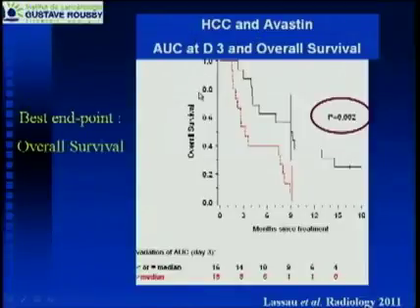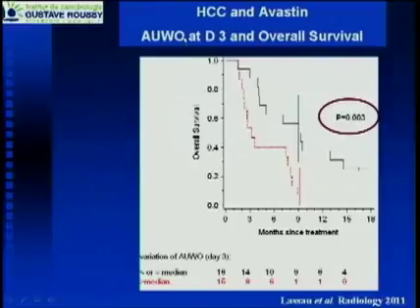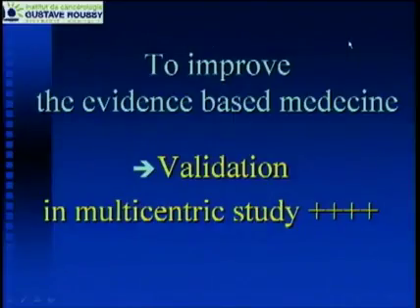And for these parameters, we demonstrate that when we perform the DCE-US 3 days after the beginning of the treatment, we have a correlation with the overall survival for the area under the curve and for the area under the washout. But you have to understand, if you want to validate techniques, if you want to improve evidence-based medicine, you have to validate your new methodology in a multicentric study.